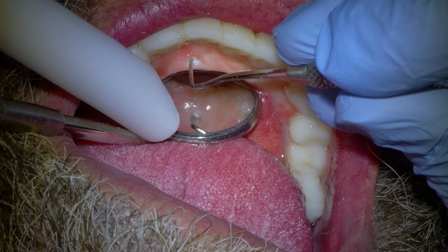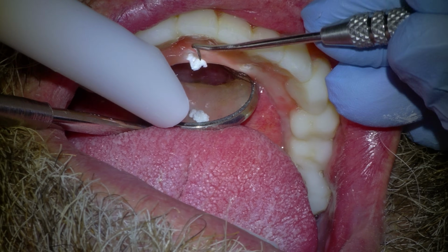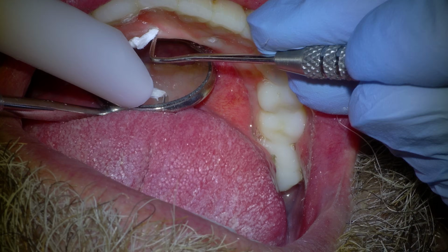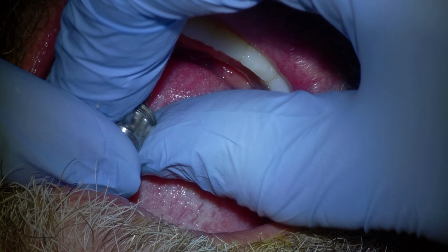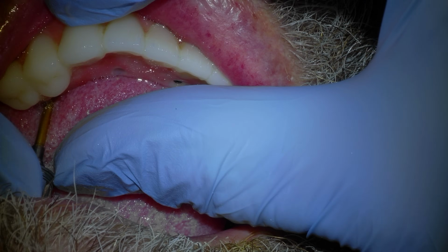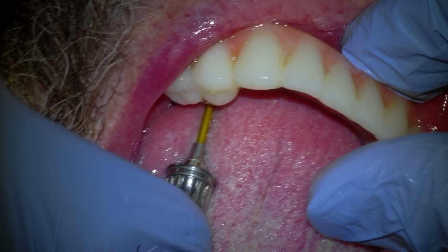With this temporary, we will make some adjustments with the desired changes, and we will take some liberties in doing so and push the limits, since the patient will only be in this for a few weeks and can always have the previous temporaries if they hate the new changes. At the appointment, once again, we take out the temporary fillings and Teflon protecting the screws. Then we unscrew that first provisional prosthesis, and now we put in the new temporary all-on-X hybrid dentures.